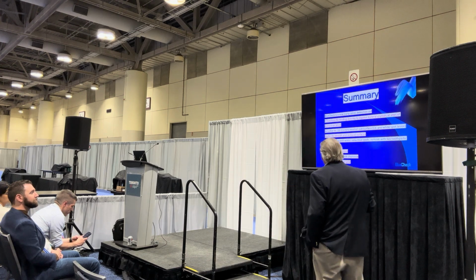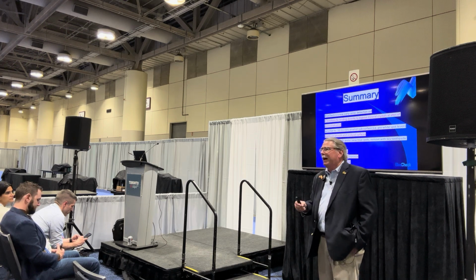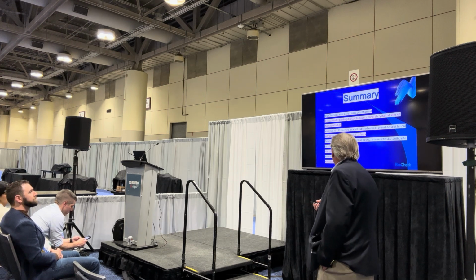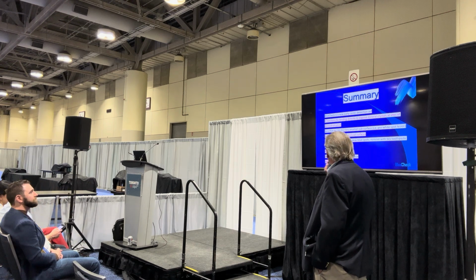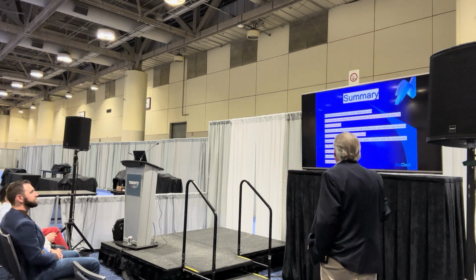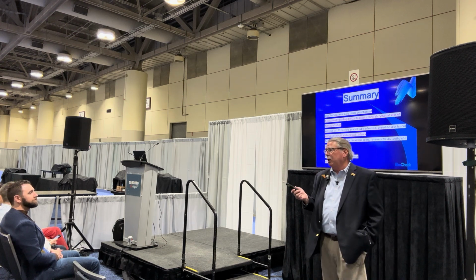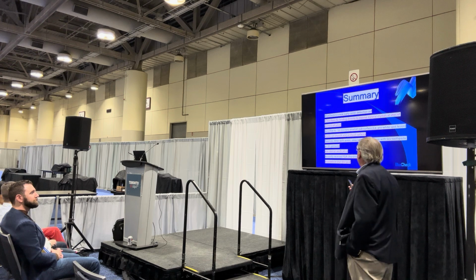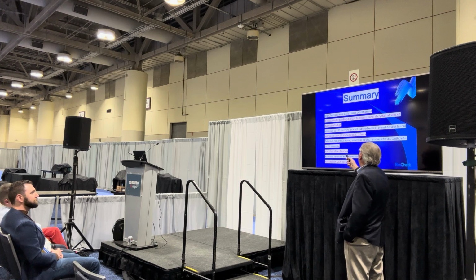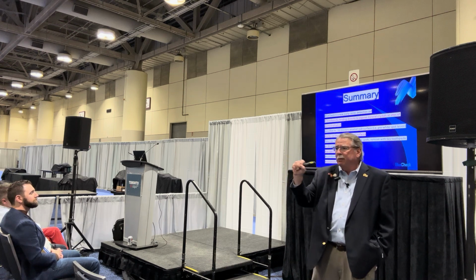So in summary, BlueCheck is pretty new. Well, here in the United States, it's new. Australia's been around a while. It has FDA approval. It functions, I think I made that clear, by directly exposing mineral crystals that have been demineralized, right? The pores and things like that. Sensitivity up to 50 microns. It's the only thing I have seen since QLF that's that accurate. It works on both smooth surfaces and occlusal surfaces. You paint it on, rinse with water, and remove it with toothpaste. You can use peroxide, but toothpaste is simple, right?